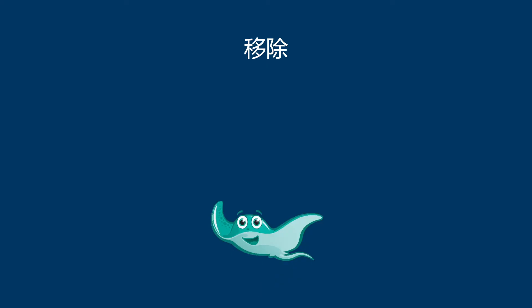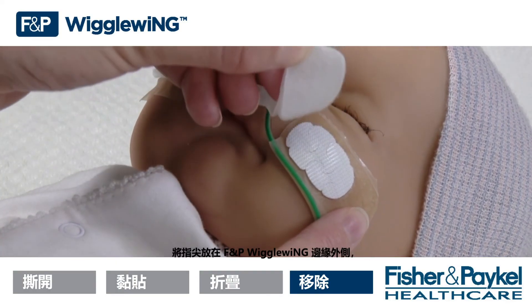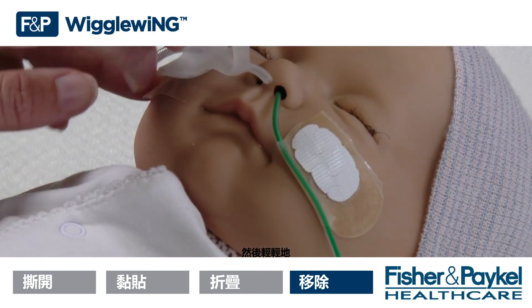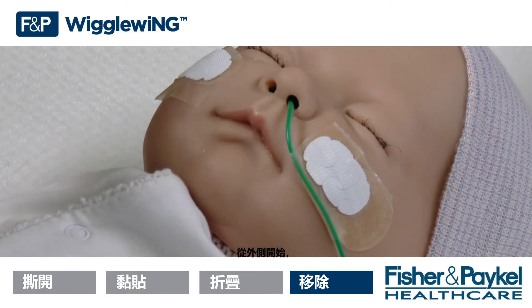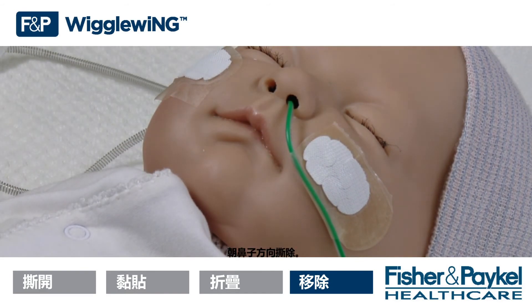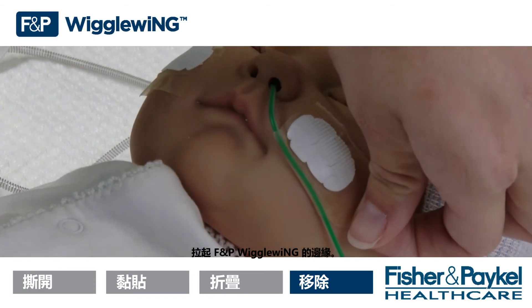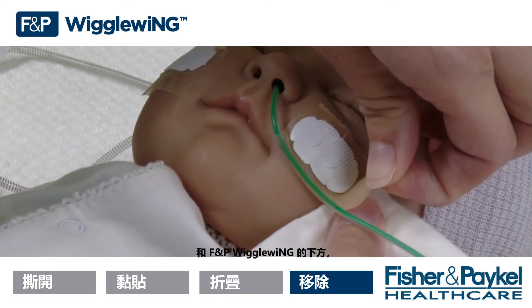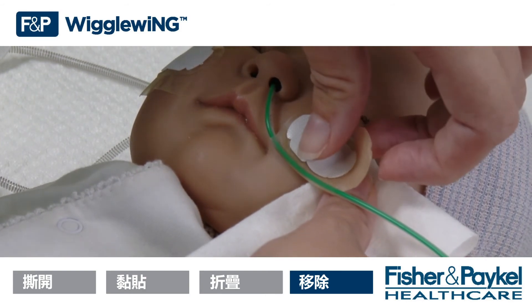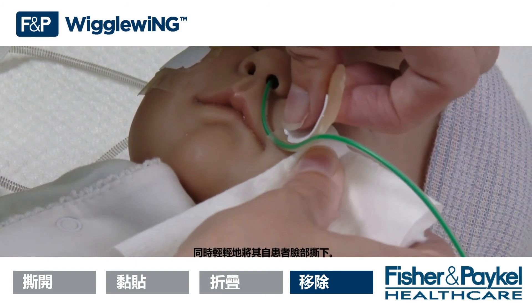Removal. Place fingertips on the outside edge of the FMP Wiggle Wing and gently peel the nasal cannula away. Starting from the outside, peel towards the nose. Lift the edge of the FMP Wiggle Wing. Use a damp cloth to wipe the patient's skin and the underside of the FMP Wiggle Wing while gently peeling away from the patient's face.